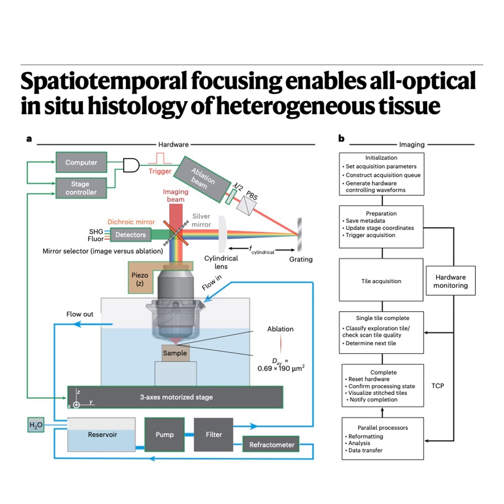Right, and the result is the ability to optically dissect and digitally reconstruct these large, complex, mixed material biological volumes like the skull and brain together that were essentially inaccessible at this level of detail before. It overcomes the limitations where mechanical cutting or simple chemical clearing just couldn't maintain the structural truth, especially at those critical boundaries.